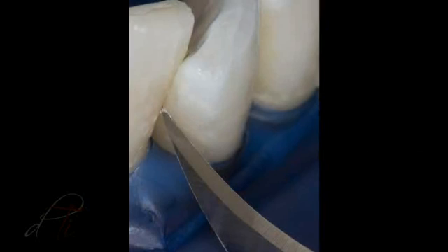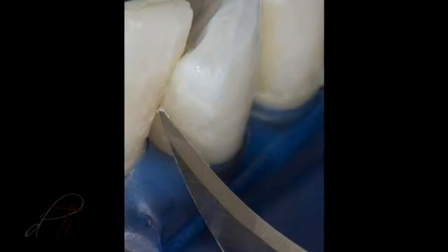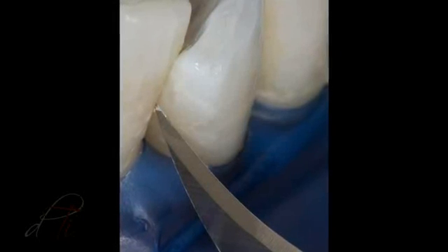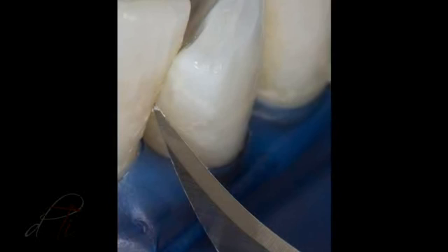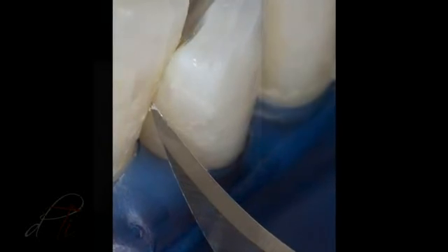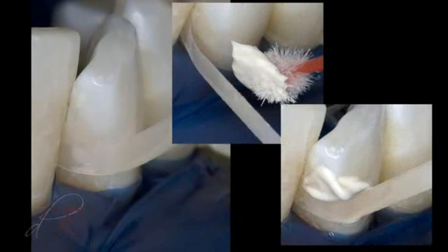The mylar strip was removed and the interproximal region was inspected for any residual composite resin tags or overhangs. The excess residual resin was removed with a surgical blade, a number 12 B.D. Bard Parker by BD Medical. The proximal surfaces were cleaned and smoothed with a loose abrasive diamond polishing paste carried into the interproximal region with finishing strips using the ET composite polishing system by Brassler USA.